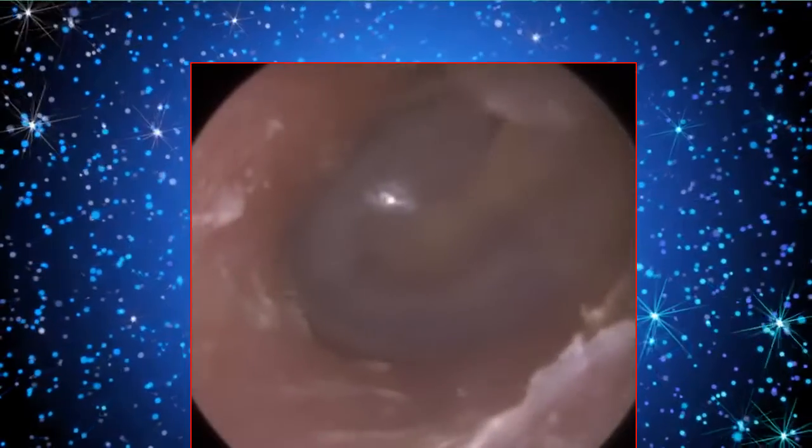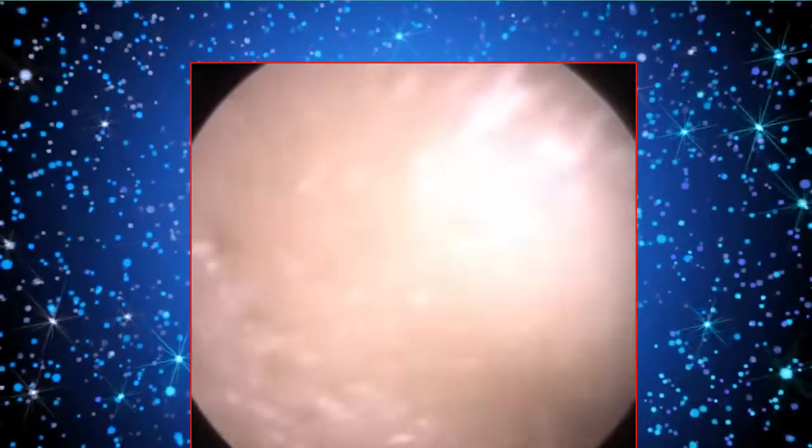The skin that lines the outer third of the ear canal is a lot thicker. It's about 1 millimetre in thickness, whereas the skin that lines the inner two thirds of the ear canal is about 10 times thinner, so it's 0.1 millimetres in thickness. Therefore, it provides less of a buffer to the bony part of the ear canal. So there's the patient's eardrum.